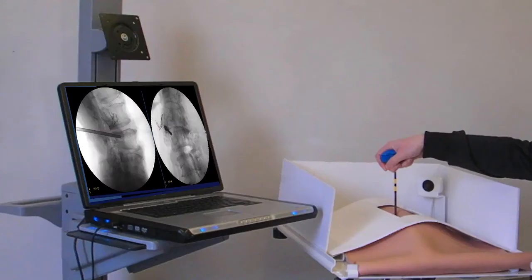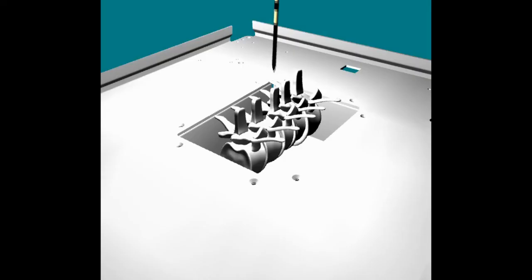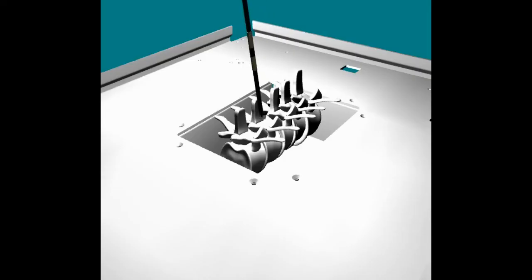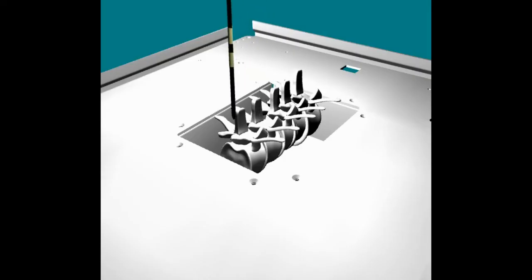As before, the new position of the needle is reflected in the new fluoroscopic image. The user also has the option to view the position of the needle and spine model in a virtual 3D view.